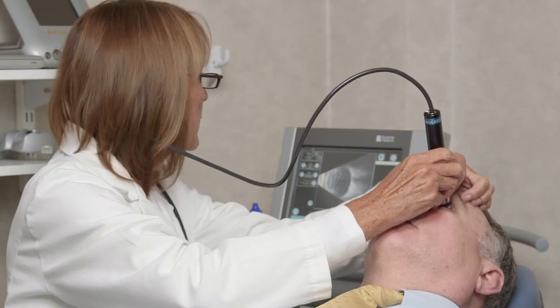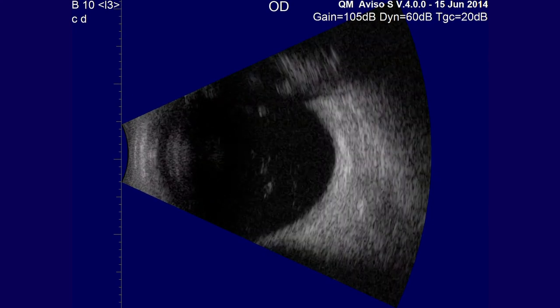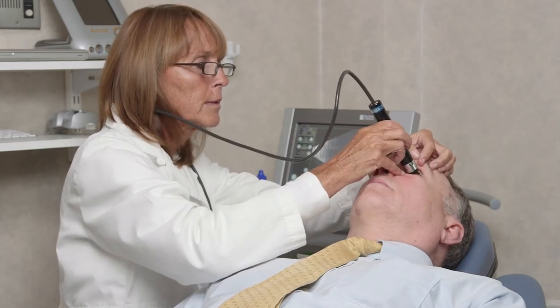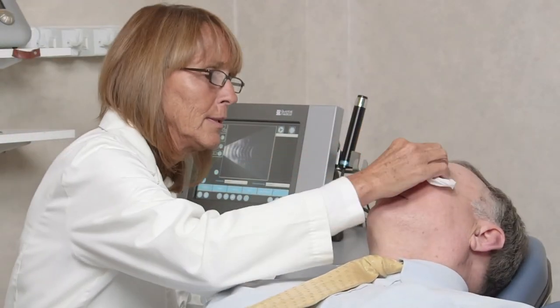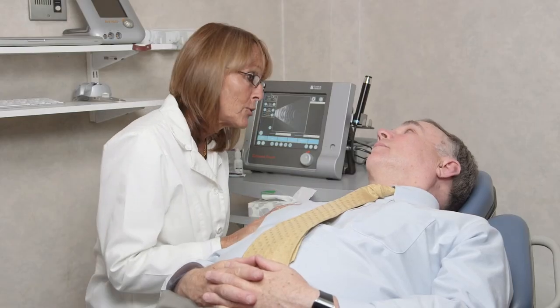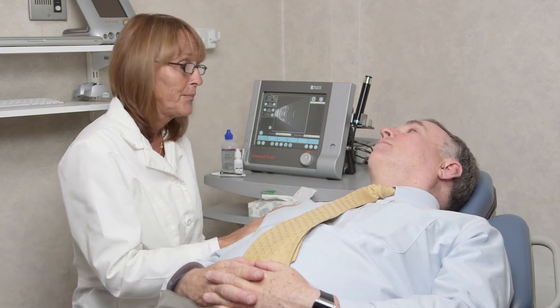When findings are normal, taking and storing one transverse scan and one longitudinal scan is generally adequate. When there are abnormal findings, be sure to take appropriate additional transverse and longitudinal scans to document the pathology. Once all images have been obtained, rinse the examined eye with eyewash and remind the patient to avoid the urge to rub the eye. Thoroughly clean the area and equipment according to the health and safety standards required by your clinic. Inform the patient of next steps regarding review and reporting of their ultrasound findings.